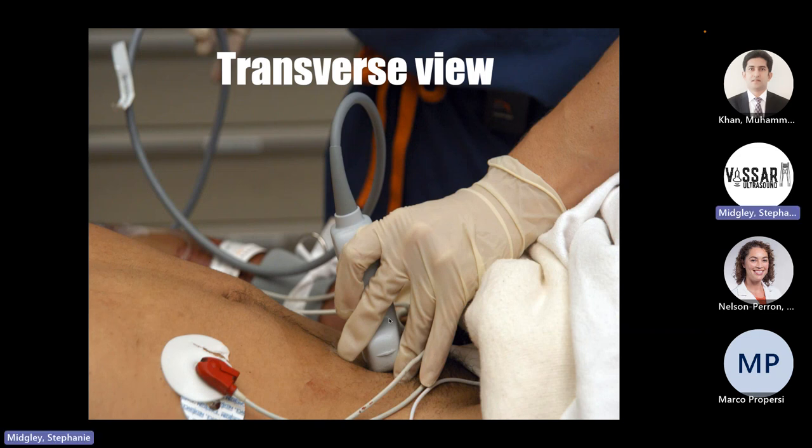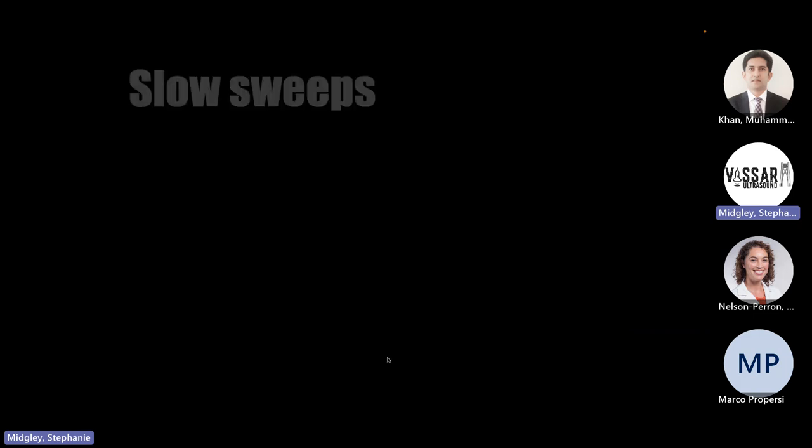So the bladder is normally tucked behind your pubic symphysis. So it is a pelvic organ. So it's really important that we don't try to find the bladder up by the belly button, because that's not where it lives. So make sure that you are down by the pubic hairline where the mons pubis is, and your beam starts at least aimed down towards the feet to find your bladder.